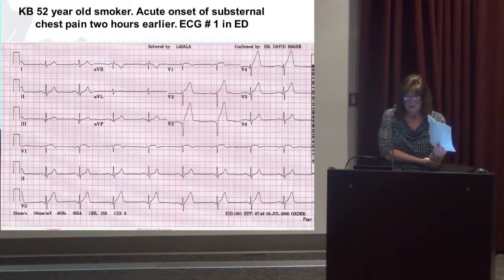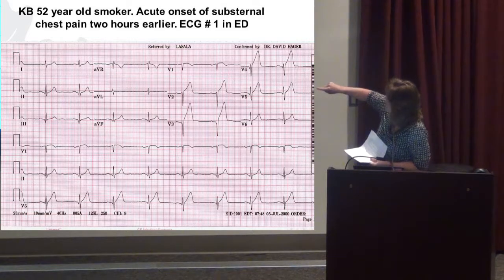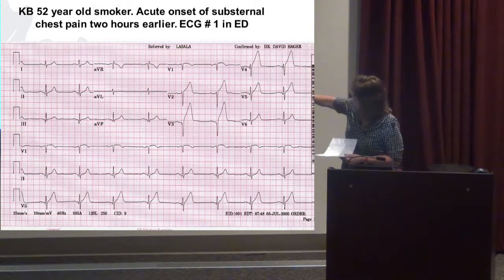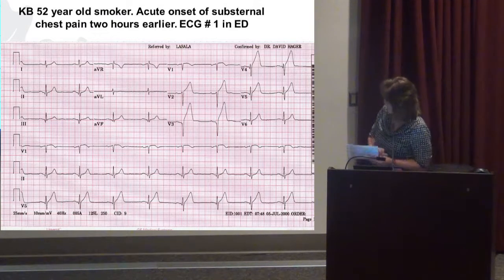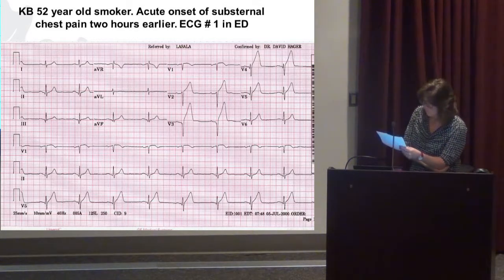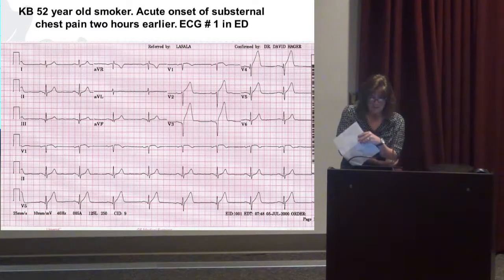Let's start with that. Well, let's orient ourselves to the 12 lead. We have lead 1, 2, 3, lead AVR, AVL, AVF, V1, V2, V3, V4, V5, V6, and then across the bottom here, you see we have 3 rhythm strips. So make sure you know what you're looking at. And they give you rhythm strips in V1, lead 2, and lead V5. Pick one. All right, so what do you make of this EKG? Is this a STEMI? What's going on with the T waves?